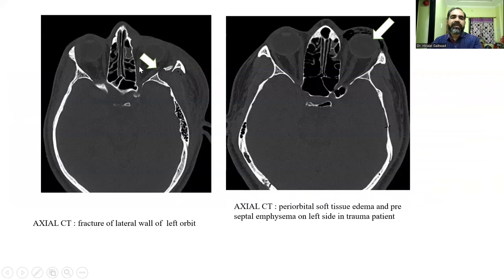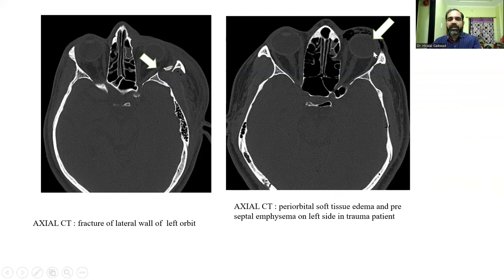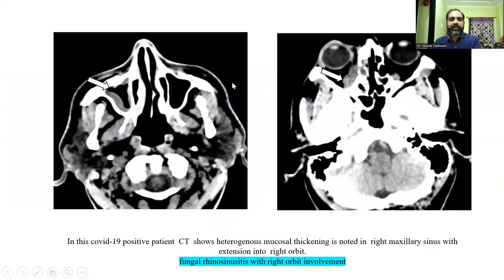These are some images from our study. This image shows the fracture of the lateral wall of the left orbit. This image shows periorbital soft tissue edema and preseptal swelling on the left side in a trauma patient.